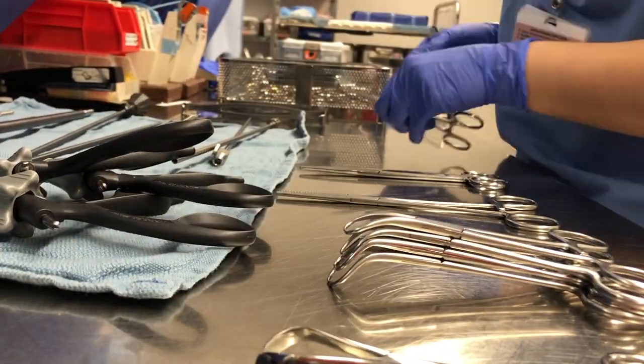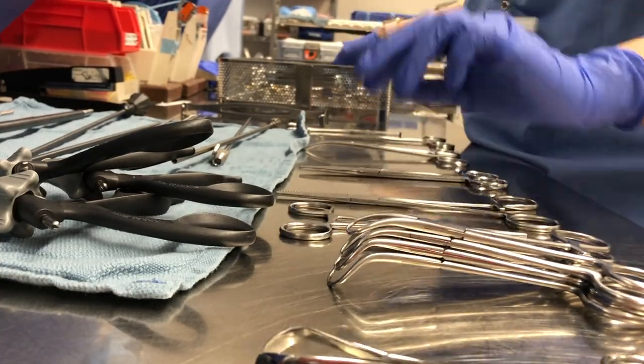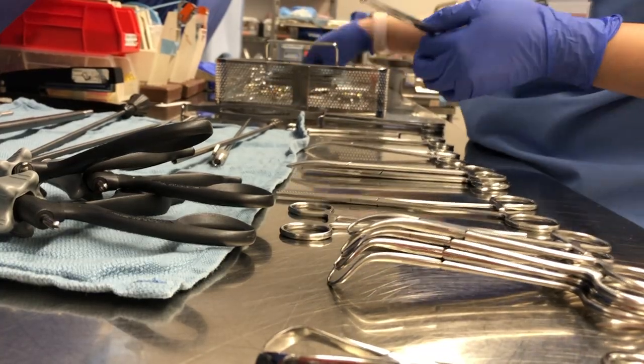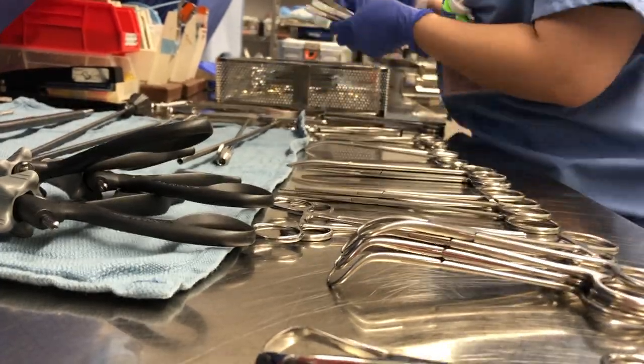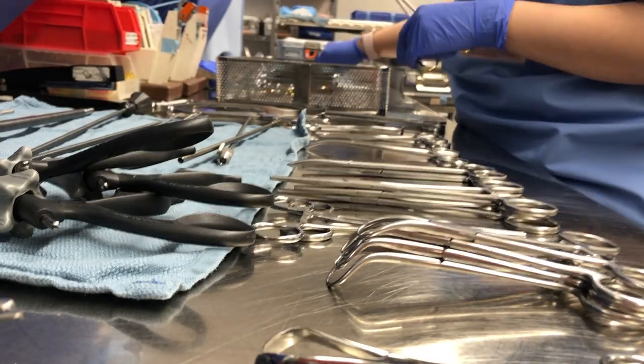As I take the instruments out of the tray, I'm inspecting them for any blood or dry tissue that may have been left on them. If they weren't cleaned properly and there's anything left on, I would clean them again. As I'm taking them out I'm also separating them by type of instrument, which makes it easier to put them together on the stringer.